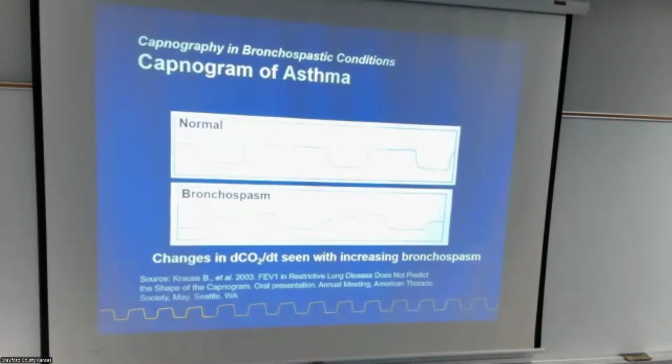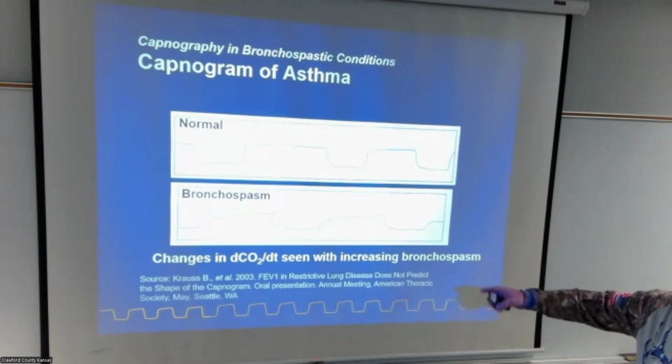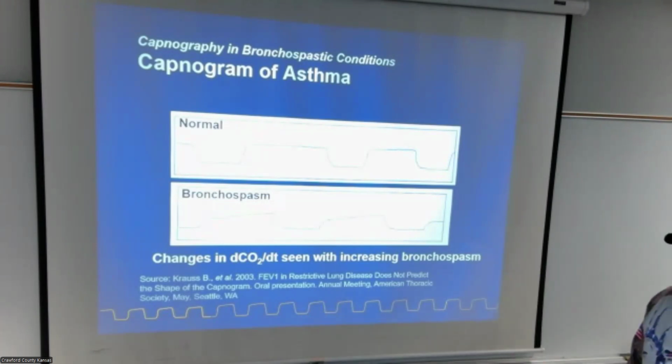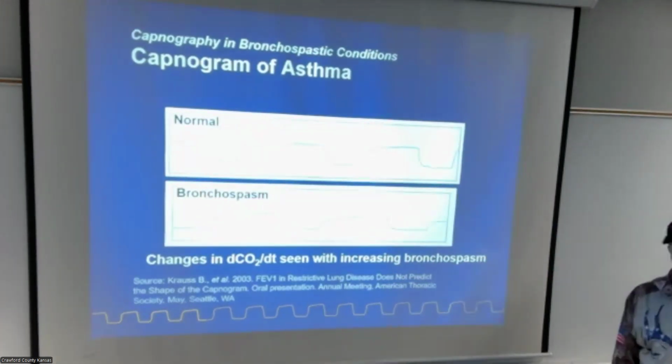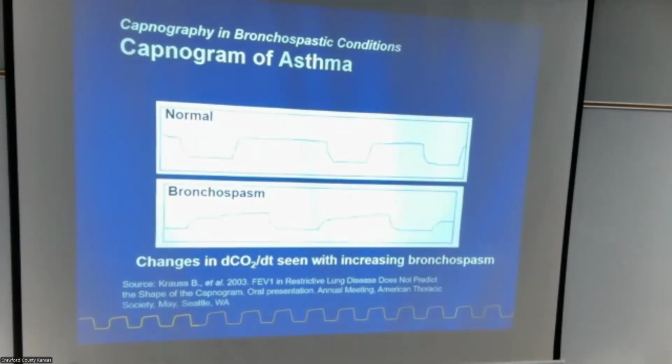Here, he's got stroke on it. So, capnography and asthma and bronchospasm. And this is kind of a real time. See how it still kind of looks like the shark fin? That's still what we're looking for. We're looking for that uneven plateau.